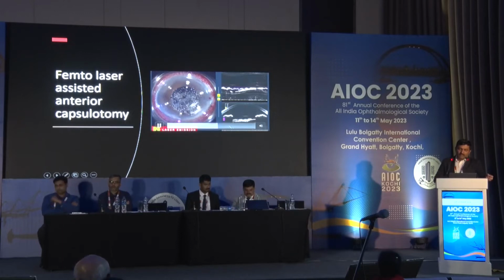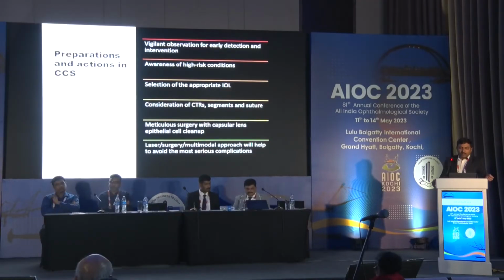Here the femtolaser is being applied. This is another method one can adopt. So what are the preparations and actions in capsular contracture? One is vigilant observation, especially in high-risk cases.